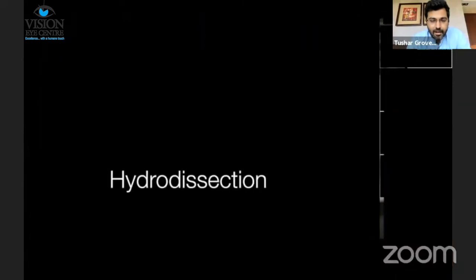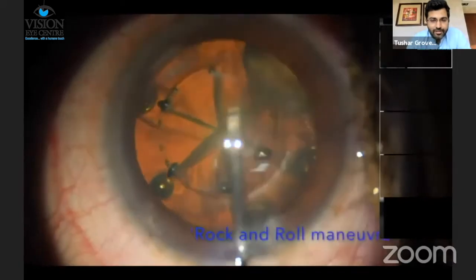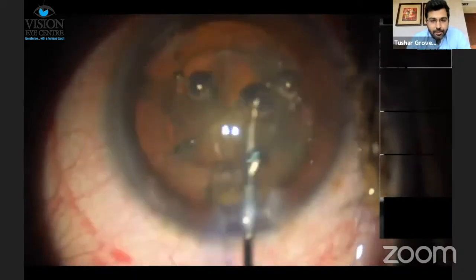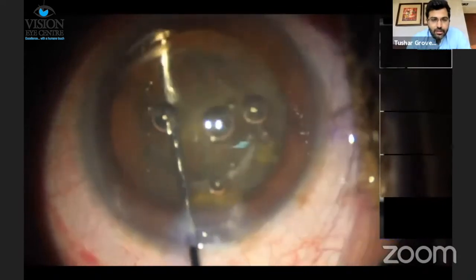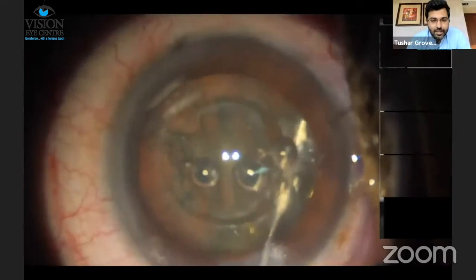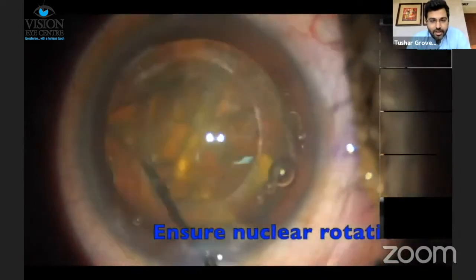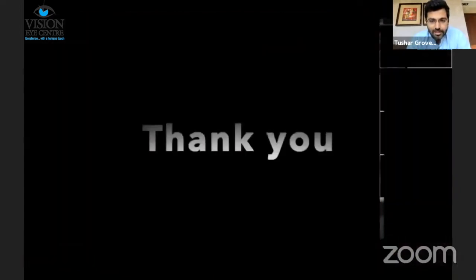Another important initial step to be careful with is hydrodissection. You have air bubbles that are trapped posteriorly, so it's best to do a gentle rock-and-roll maneuver to bring up these posteriorly trapped air bubbles. Once you've done that, perform a gentle hydrodissection — it's important to be a little more gentle in these cases compared to routine phacoemulsification. And as in routine cases, ensuring nuclear rotation is also important in these cases.